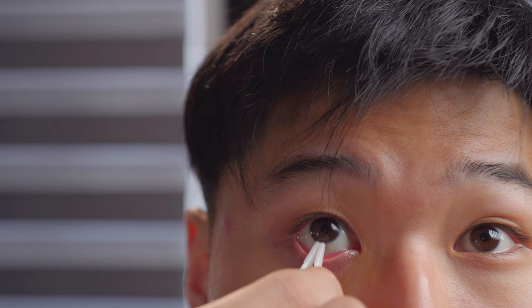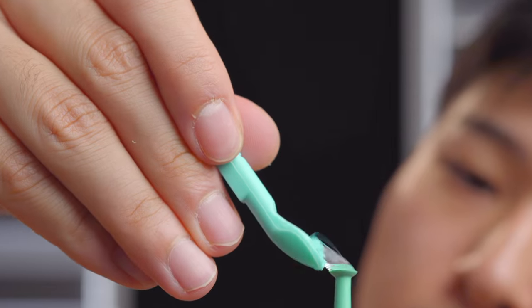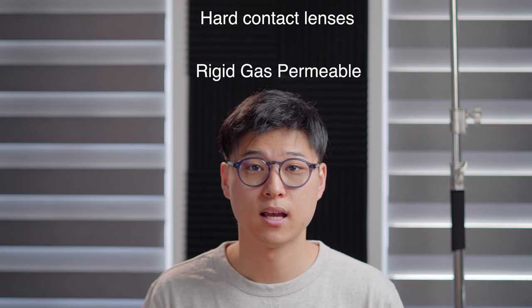To make it a little bit more fun, I've designed a challenge for myself: can I put in and remove contact lenses using these tools in a safe and quick manner? At the end, I'll give you my opinion on whether or not I would prefer these over my own fingers. As a bonus, I've included a tool specifically made for hard contact lenses, also known as rigid gas permeable lenses. In a minute, you'll see why they are for hard lenses and not for soft ones.